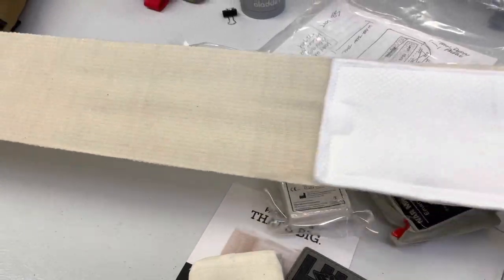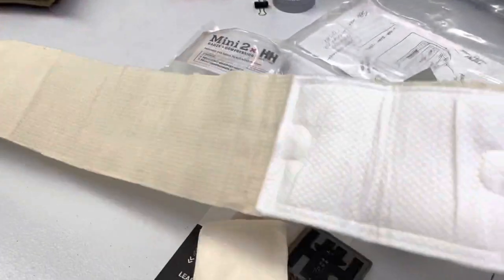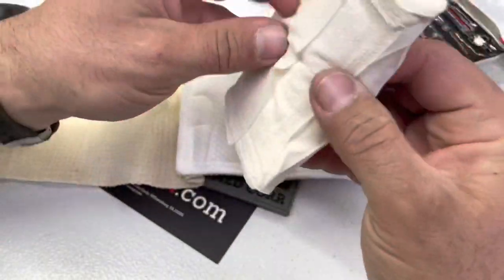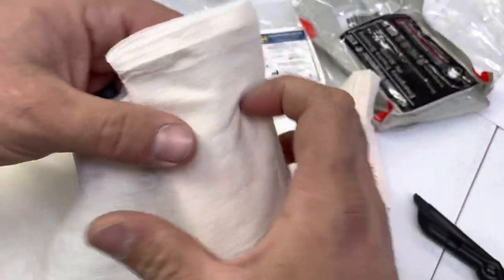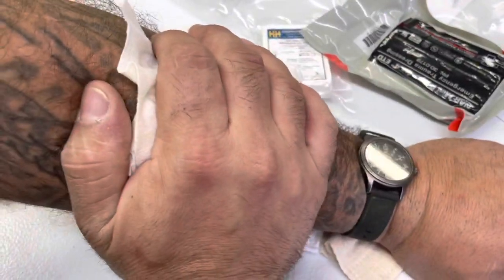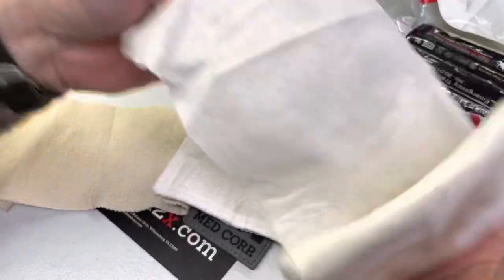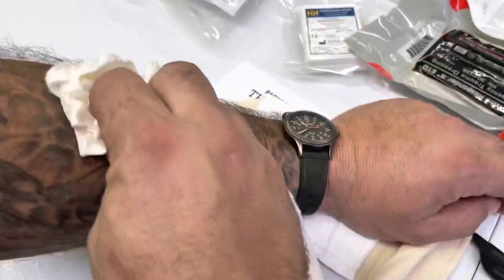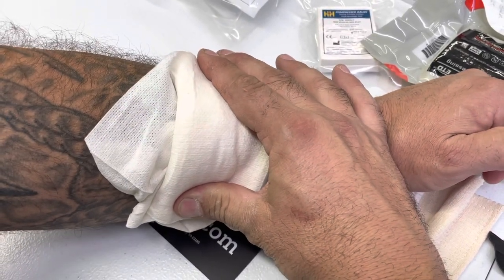The bandage is about three feet long before you stretch it, it's pretty stretchy, and it's got retention clips on the end. It looks like about a four-inch by six-inch gauze pad, with a big soaker pad and linen for packing. You could put this directly over a wound to apply pressure to a superficial laceration, or for a deep wound you'd pack the linen into the wound and lay the pad over the top.